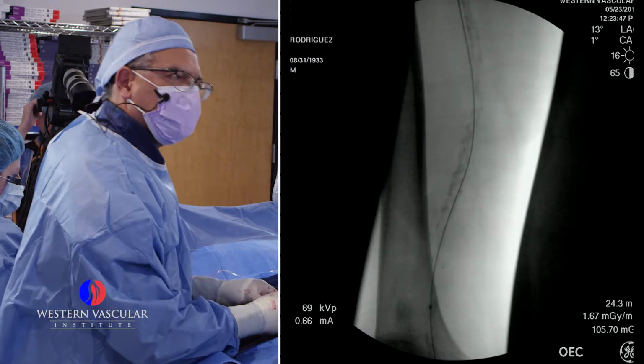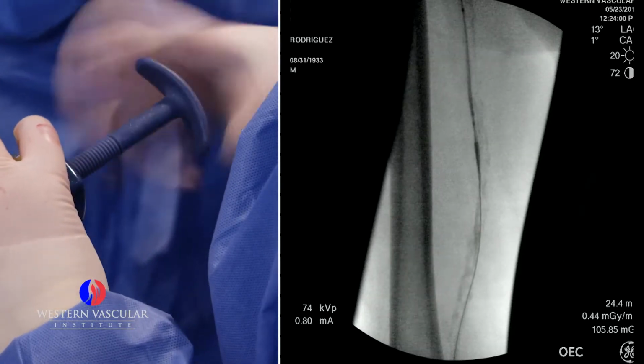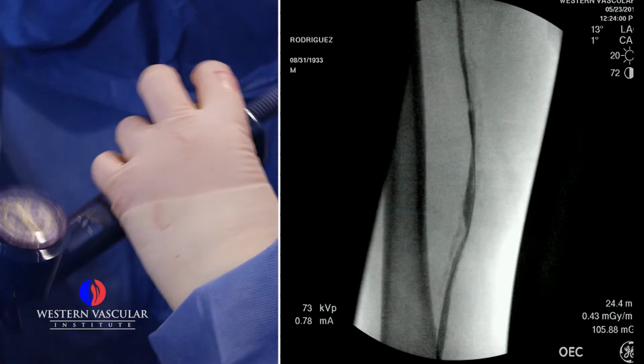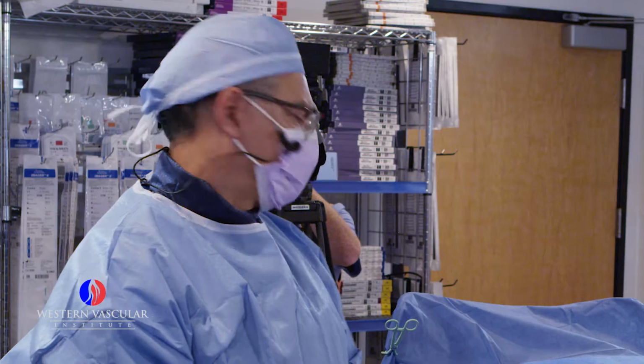Okay, from here up. Good. 30 seconds on this one. Go ahead. Go ahead. 14. Yeah, we can see the irregularities on the balloon. Still that spot down.